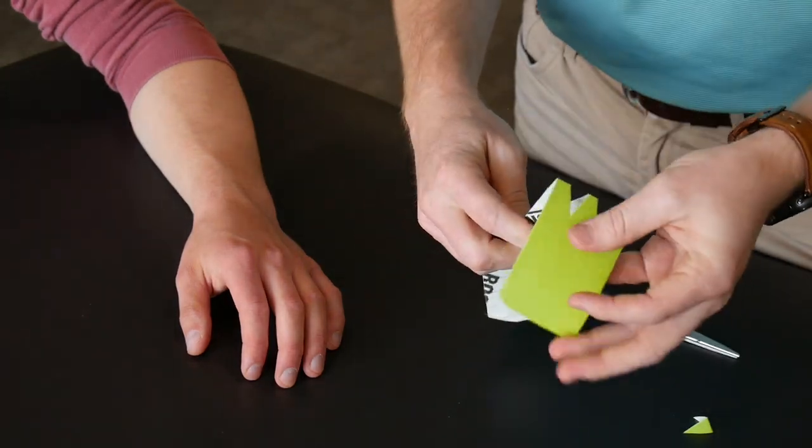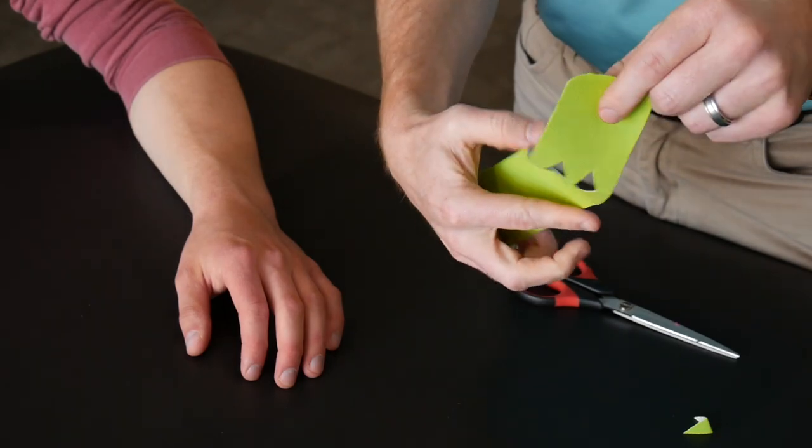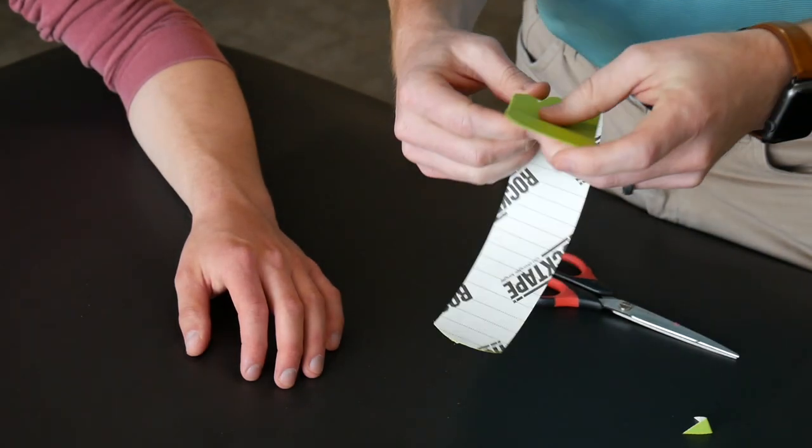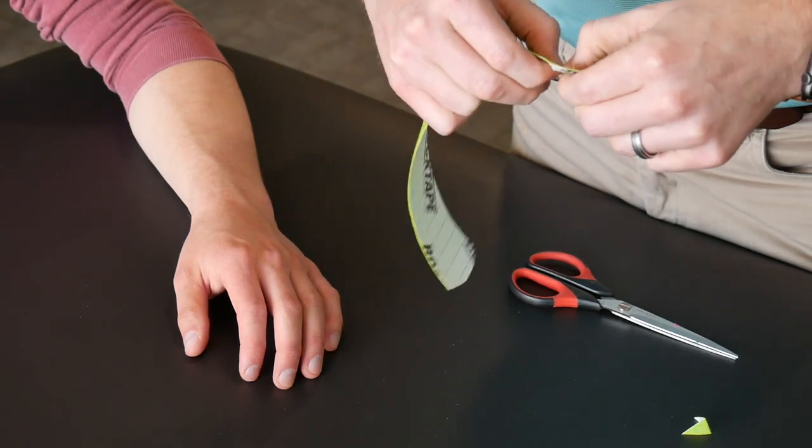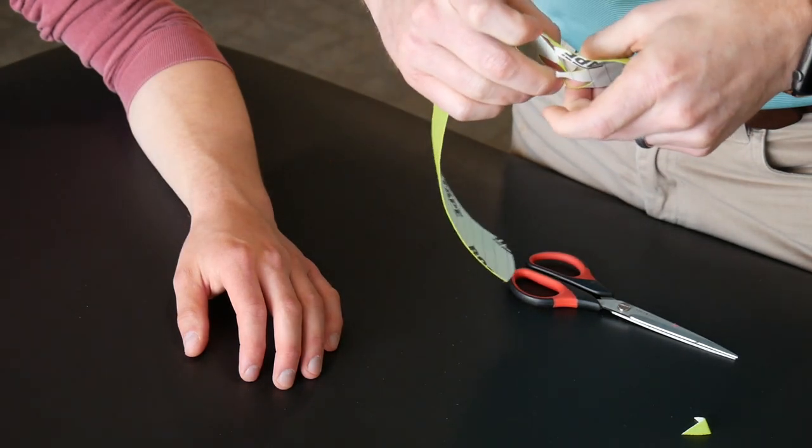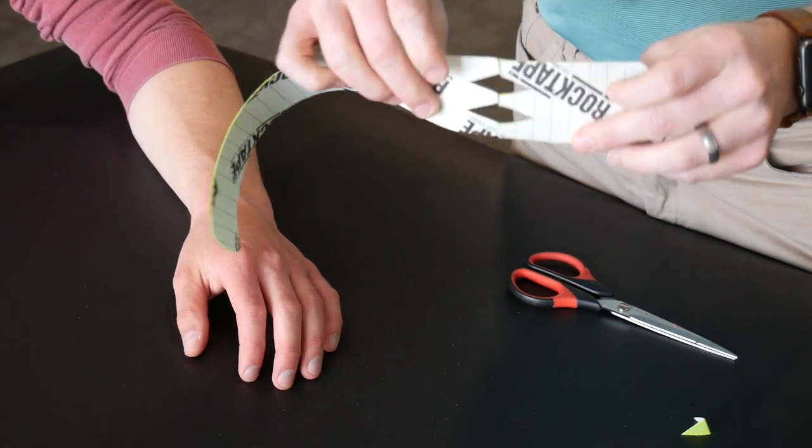So it'll look something like that. And of course, when you open it, you've got somewhat of a diamond shape. So when you're taping, you want to go ahead and tear right at the triangles or the diamonds, but don't pull that tape away just yet.